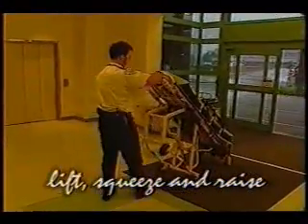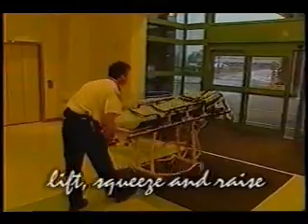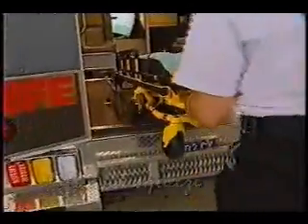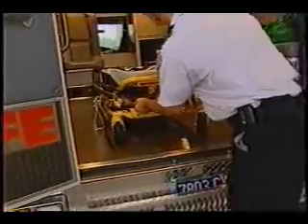One person can raise an unoccupied cot to loading position without a problem. Just tip it onto its load wheels, squeeze the height adjustment release handle, and extend the base frame until it locks into position. Again, since you're in the highest or loading position, release the auxiliary lock, lift the cot, and squeeze the height adjustment release handle completely as you push the cot into the ambulance.